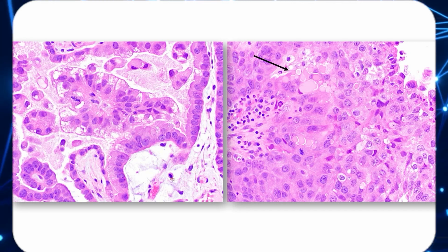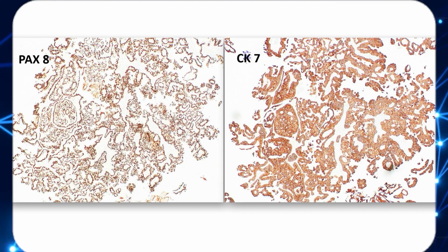This is again a real significant hallmark which is noted in clear cell carcinomas arising from the urethra. So PAX8 and cytokeratin 7 was performed on the resected sample. Both came back positive, PAX8 being strongly nuclear stained and cytokeratin 7 giving you a cytoplasmic staining.